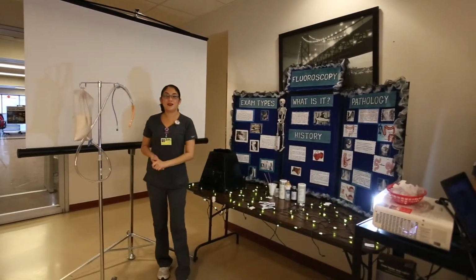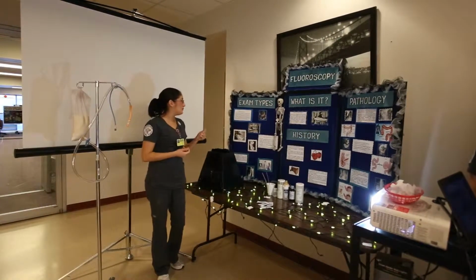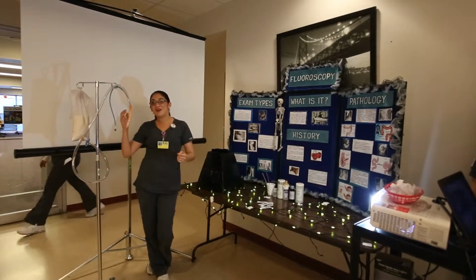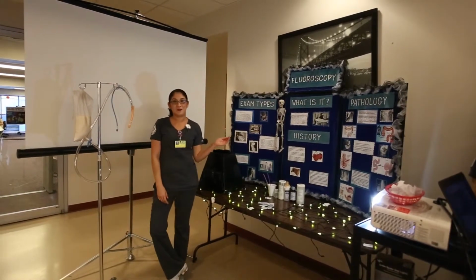Okay, my topic is the exam types that we do under fluoroscopy. Can you hear me? So one of them is barium enema. What we do in barium enema is we actually have contrast and highlight the organs and anatomy of the body.